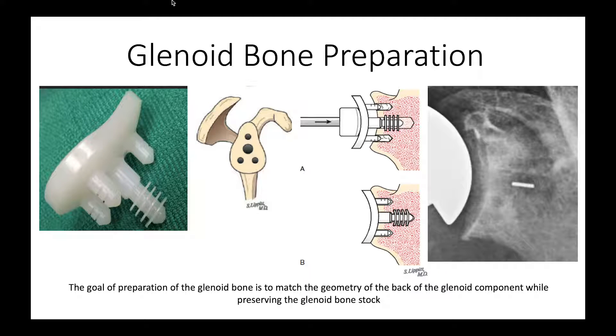The glenoid we usually use is this all-polyethylene glenoid that has fluted central pegs for bone ingrowth. This has the advantage of a very precise geometry, preserving a lot of glenoid bone stock, and also using ingrowth fixation in the central peg and additional fixation in the peripheral pegs. When we drive this component into bone, these flutes bend, as you see here, and create good initial fixation. Subsequently the bone will grow into those flutes and provide additional fixation.